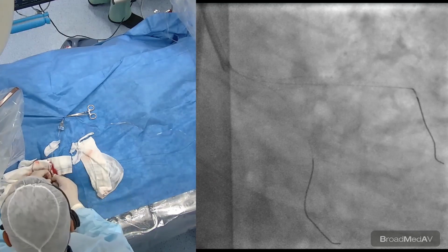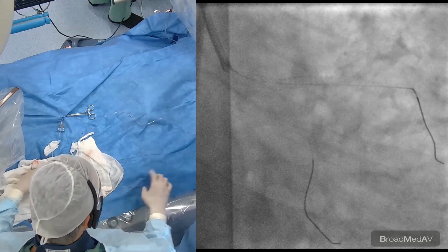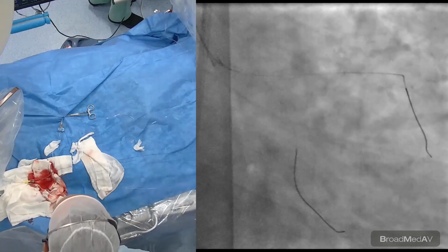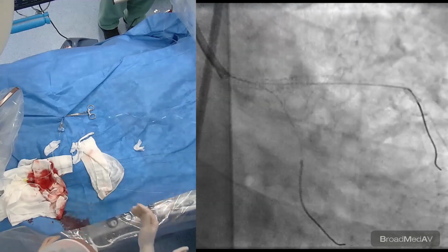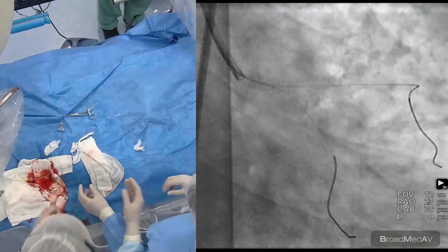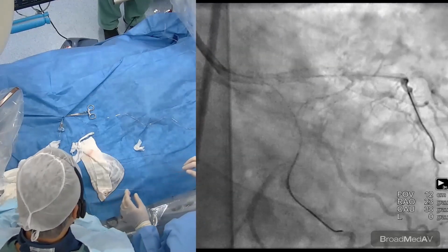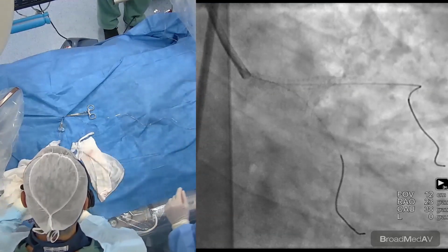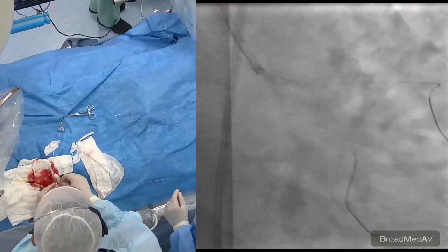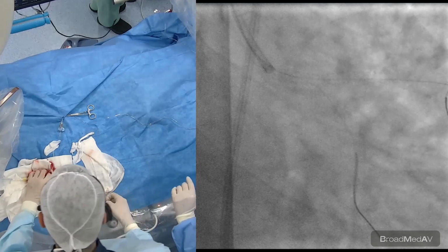Okay. So, go slowly. So everything is fine here. Can we do a control angio here, Rodolfo? Hold on. You can go. So you went up to 16, 17, 20, 26. So distal in the LAD, he went to 18, and then in the proximal, 26. It's interesting to see, again, the circumflex ostium. So you went up to 18 in the distal LAD and to 26 in the proximal. Exactly. Is that correct?